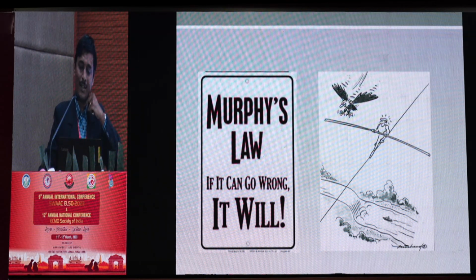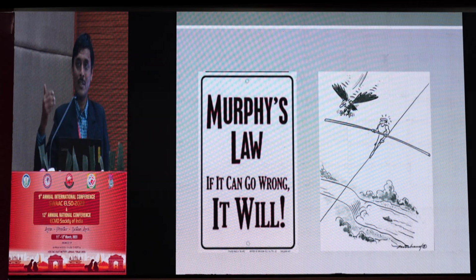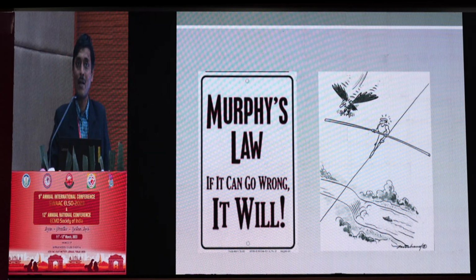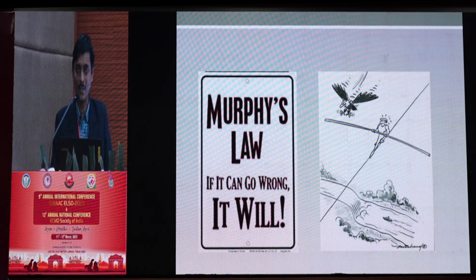Now, the reason why I'm saying that is when you have a patient on veno-venous ECMO, the very first decision to go on veno-venous ECMO was to offset hypoxemia. Now, you have a patient on veno-venous ECMO who's still continuing to desaturate. That is a matter to worry. How do you deal with it? Clearly, the purpose for which the VV ECMO was started is not working well, and you need to think about why it is not working well. Now, let's go further into questioning why it's not working well.